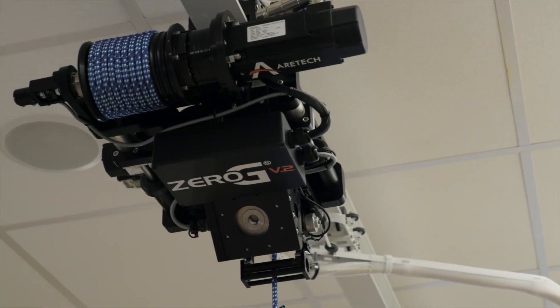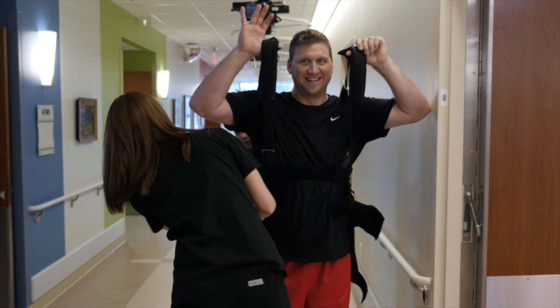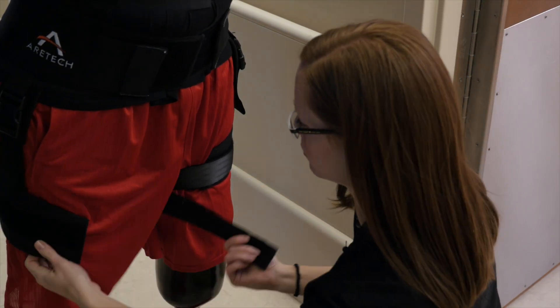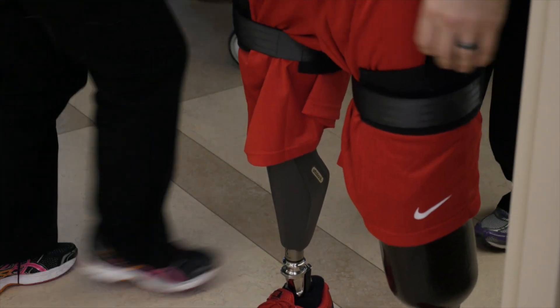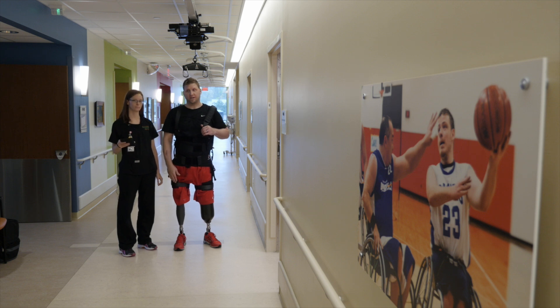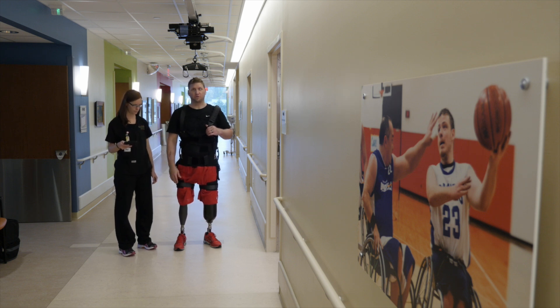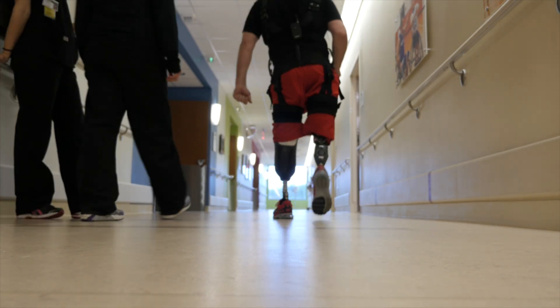This is a Zero-G, the dynamic body weight support system where we can take some weight off of Eric and won't let him fall. He can pretty much practice whatever he wants while hooked up in the harness. He had his prosthetist set up the running mode on the leg, which gives a little bit more free motion to run, so it kind of keeps up with his body motion — we're gonna try that out.